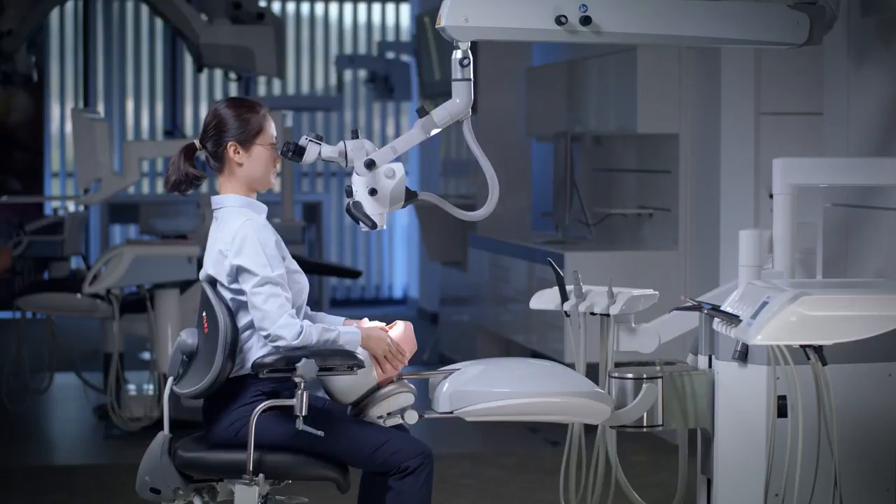Adjusting the microscope and your posture in the way shown can help to prevent posture-related musculoskeletal disorders.